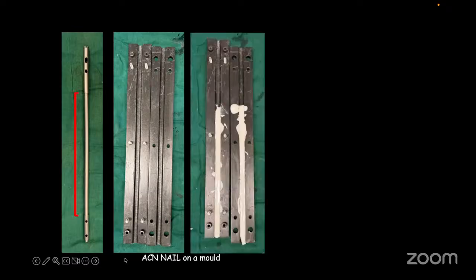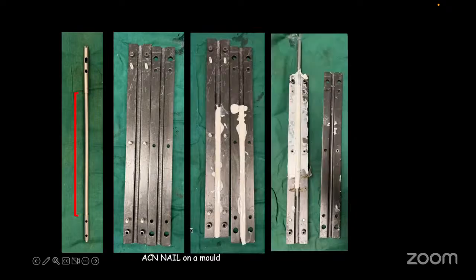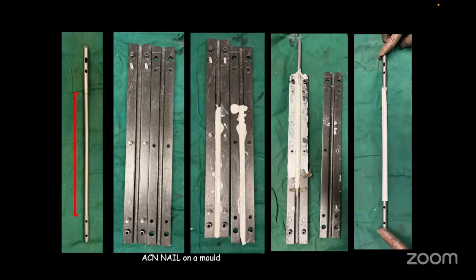You have to line the center of the die, the slot inside on both sides, with the cement, then put your nail inside the die, and close the male and female parts like this, so that when the cement solidifies, you have an antibiotic coated nail like this, which has 2 proximal and 2 distal holes. This is for the femur.